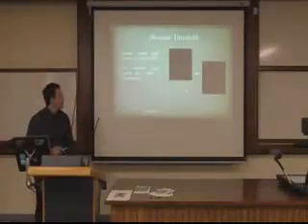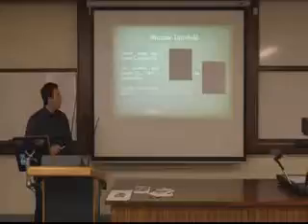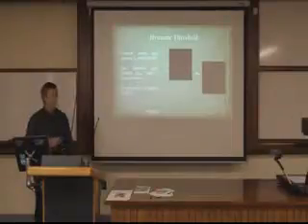And so first of all, in each region of interest, I find the average pixel intensity. And then I find the pixel intensity within a fiducial marker, and I use these to binarize the ROI. And this is dynamically adjusted for every circumstance. It's not arbitrary or anything.